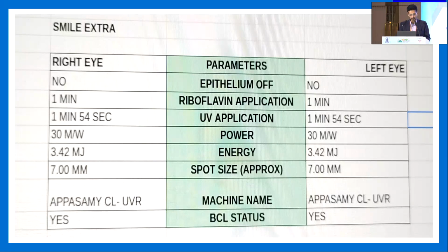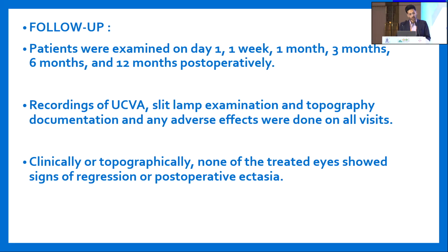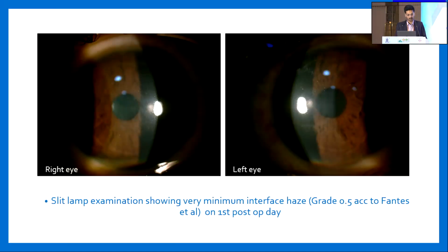The follow-up was done at day 1, 1 week, 1 month, 3 months, 6 months, and 12 months post-operatively. The recordings of uncorrected visual acuity, slit lamp examination and topography documentation will be discussed thereafter. Clinically and topographically, none of the eyes showed signs of regression or post-op ectasia.